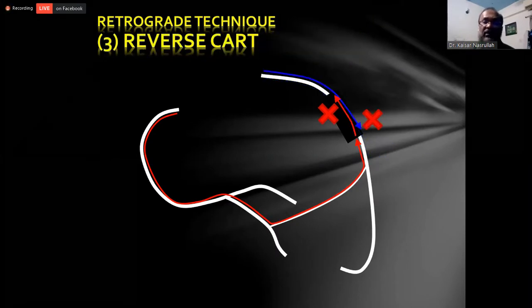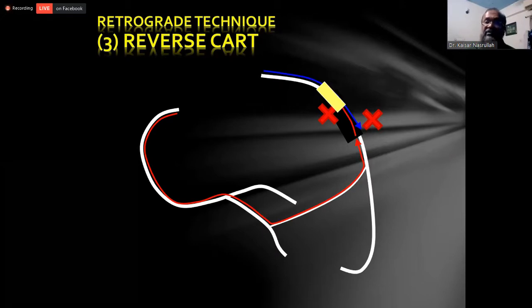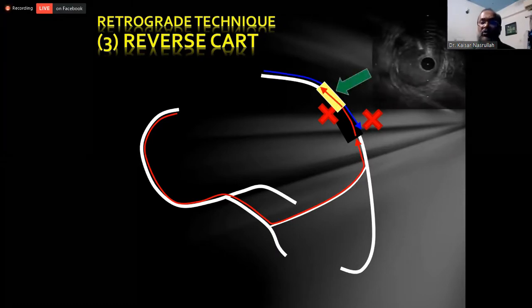Next is reverse CART, which is very popular now. When the retrograde and antegrade wires are in different planes, you put a balloon on the antegrade wire, increase the dissection plane, and then try to reach that dissection plane by retrograde wire, and then go to the proximal true lumen.